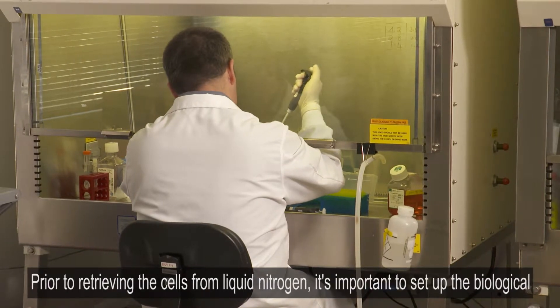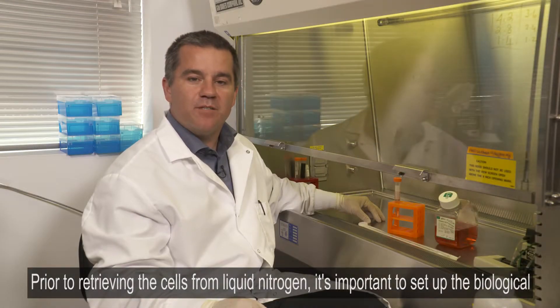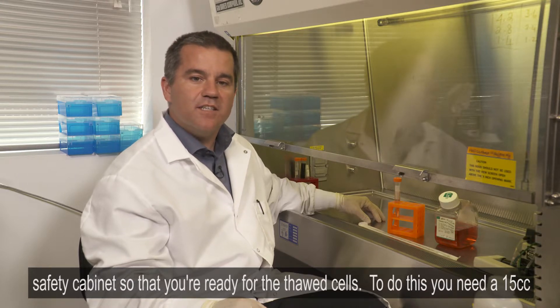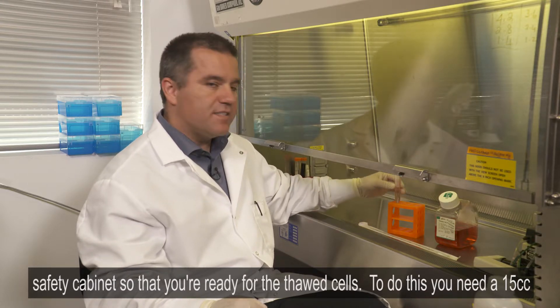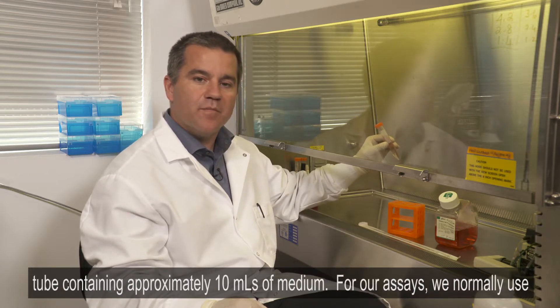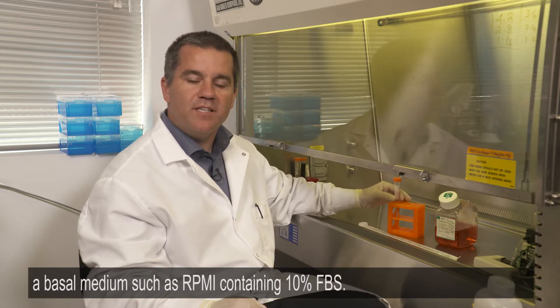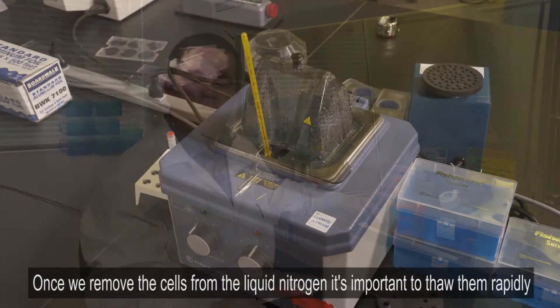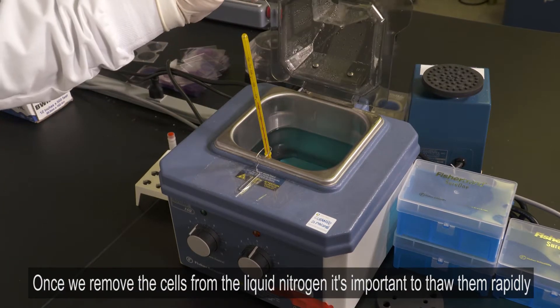Prior to retrieving the cells from liquid nitrogen, it's important to set up the biological safety cabinet so you're ready for the thawed cells. To do this, you need a 15cc tube containing approximately 10 mils of medium. For our assays, we normally use a basal medium such as RPMI containing 10% FBS.